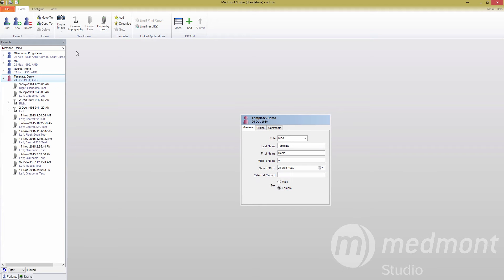Hello and welcome back to Medmont's M700 tutorial videos. In this video, we will explore how to edit and build new test templates.